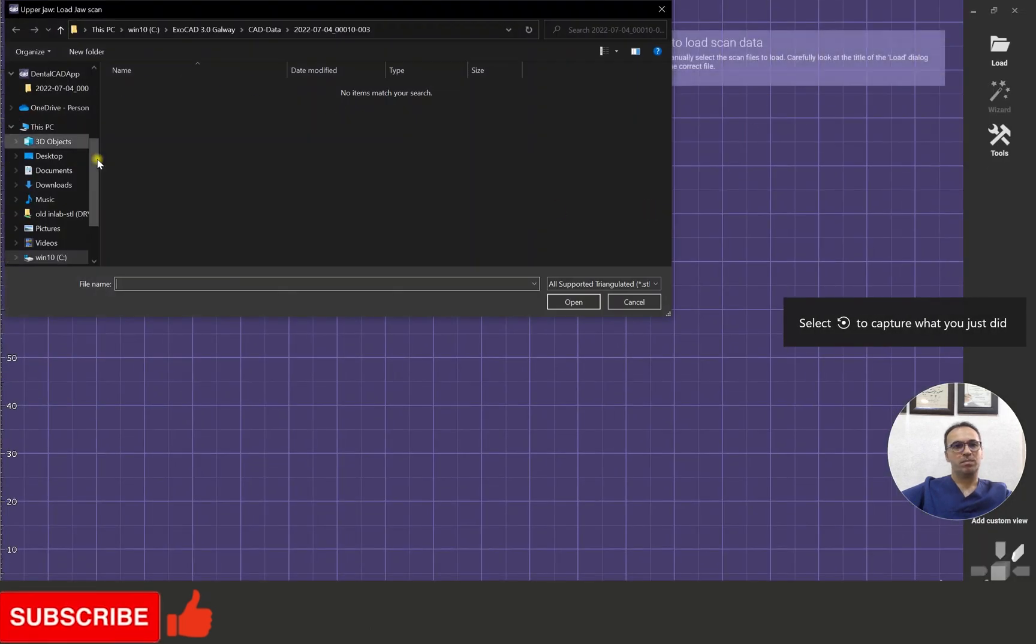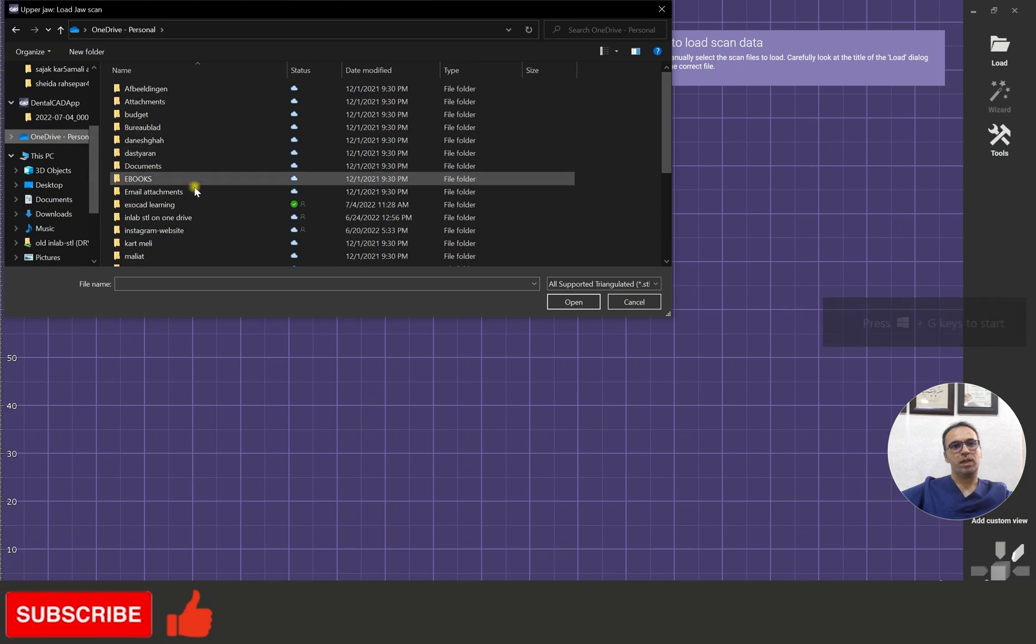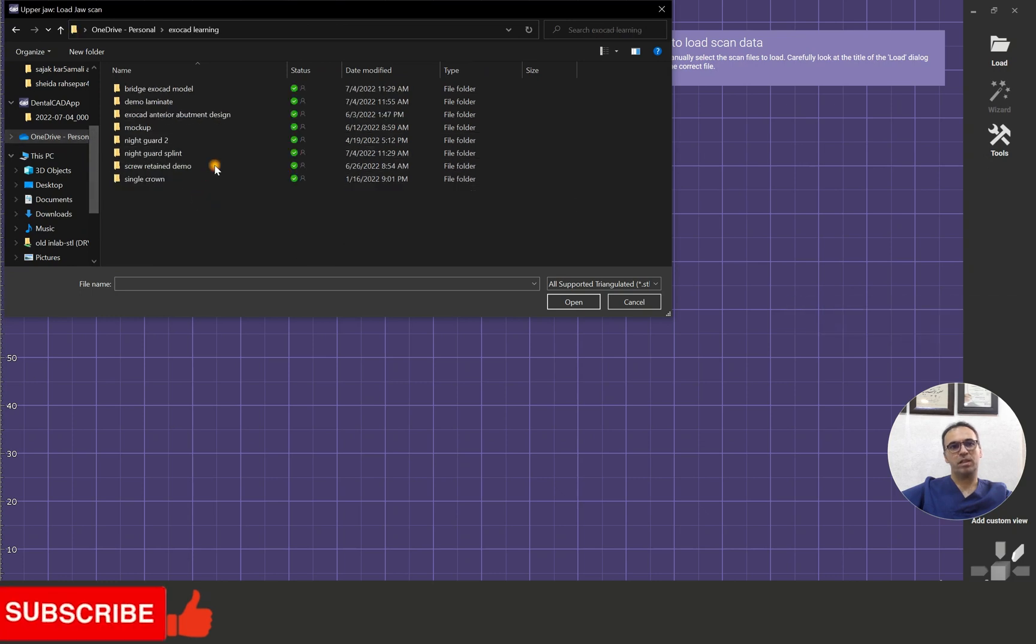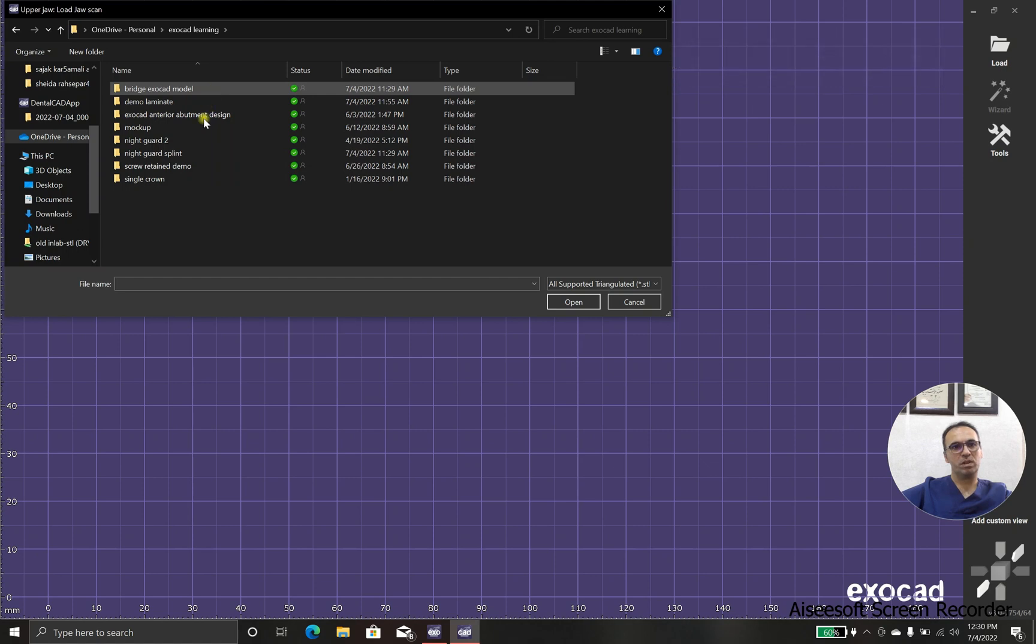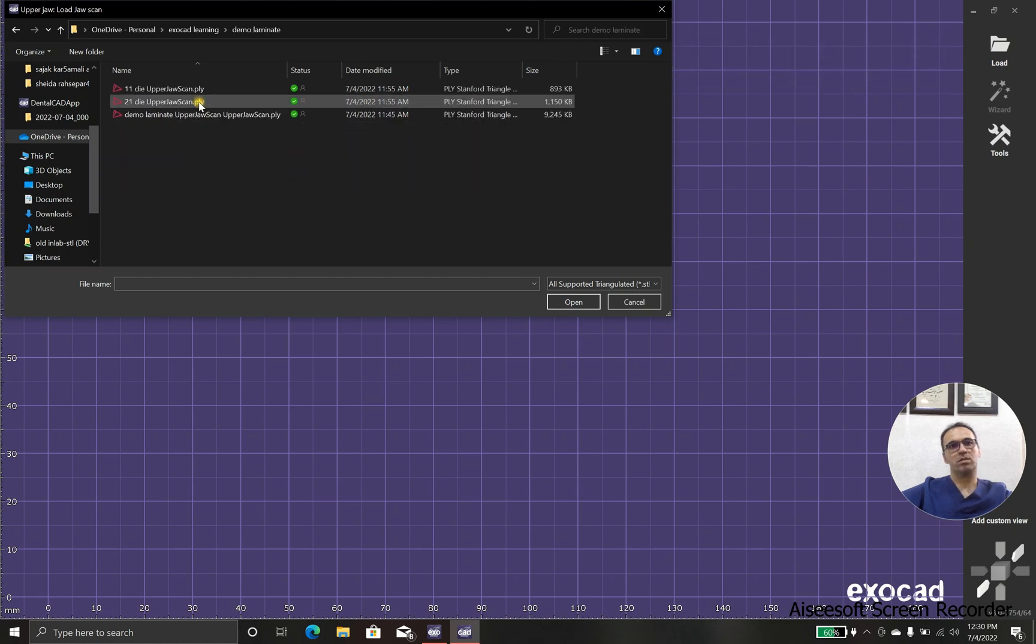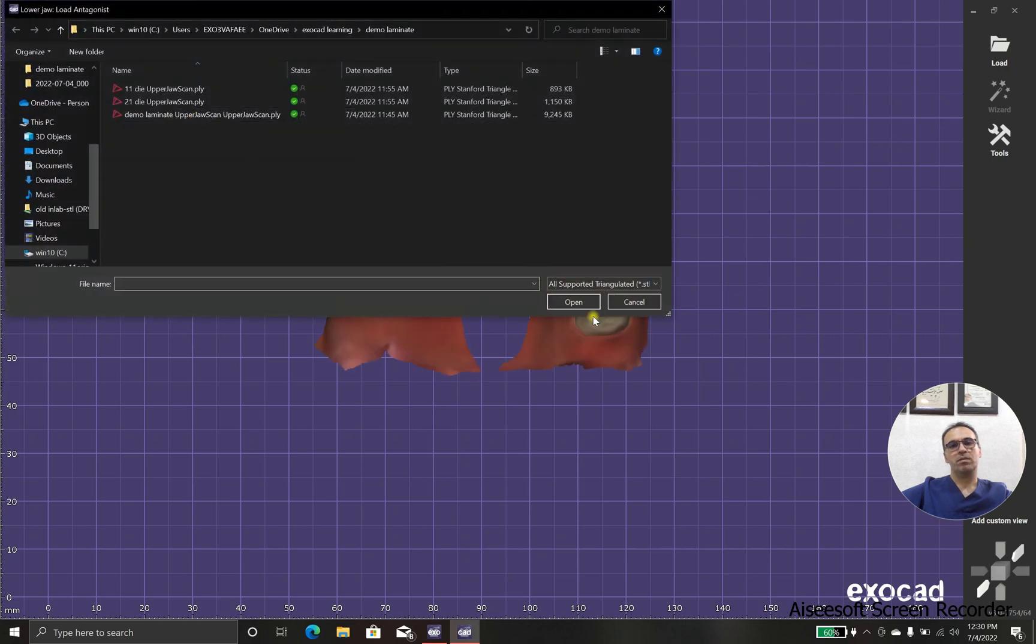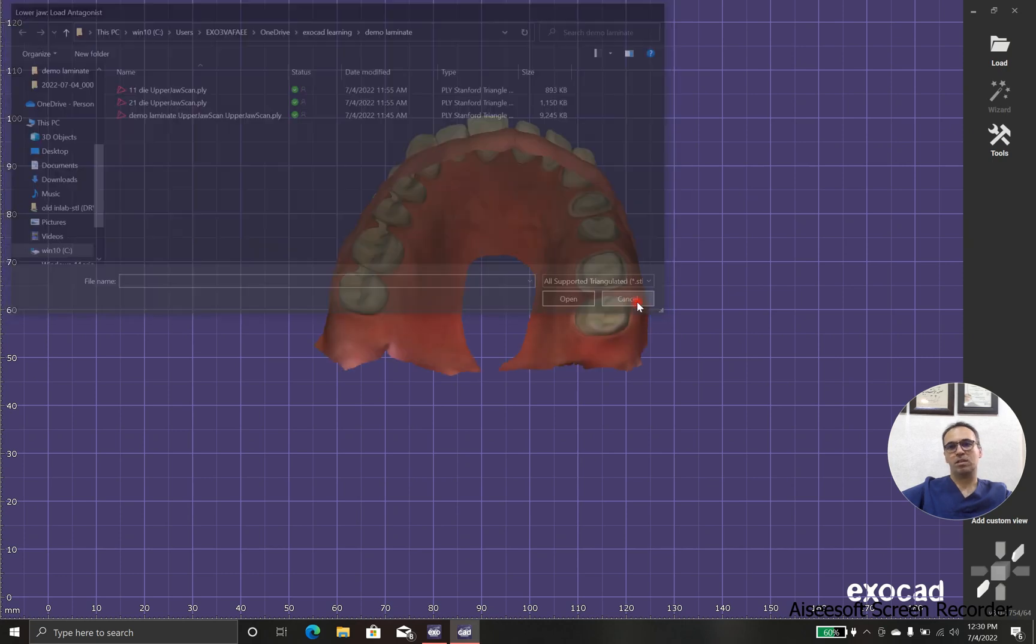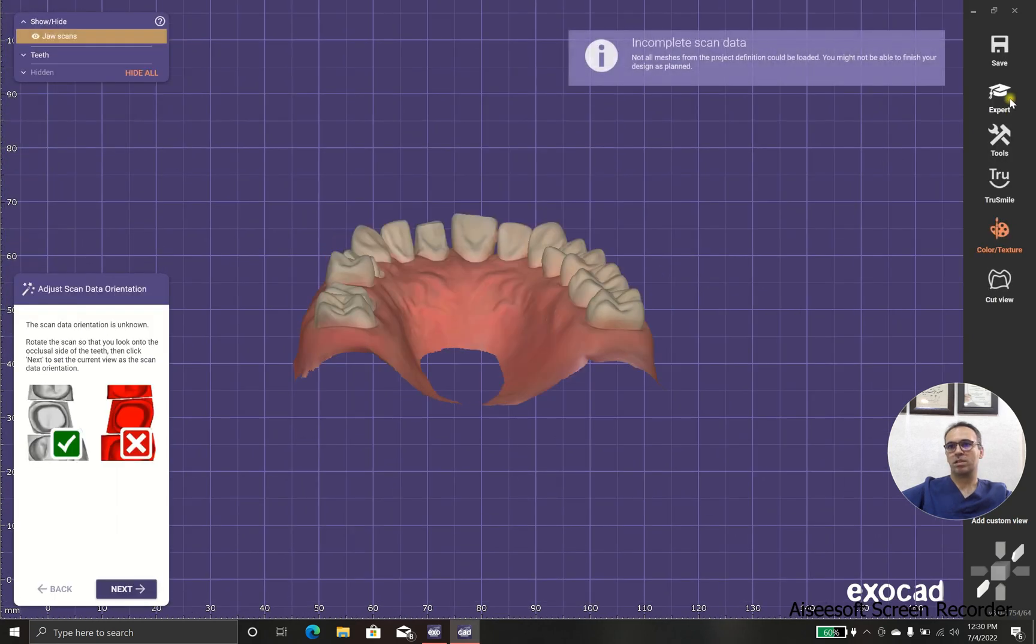Okay, and we have extra dies and we have main scan, so first of all, I'm going to choose main scan, where it is, yeah, and after that, we don't have opposing because we are going to save the time.